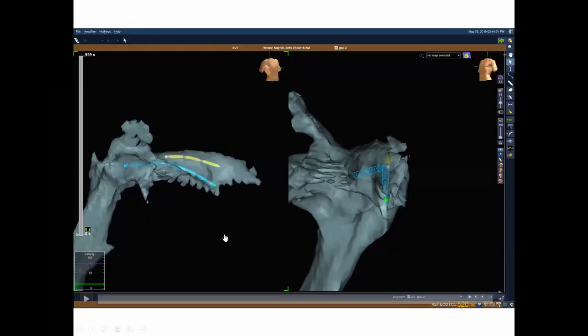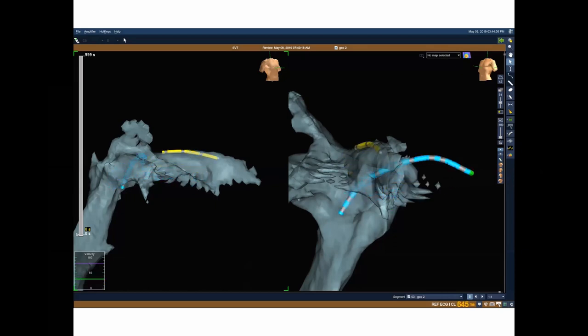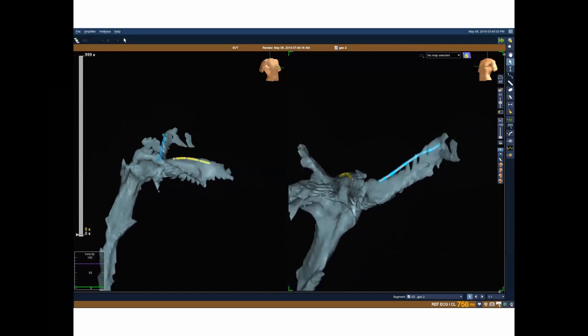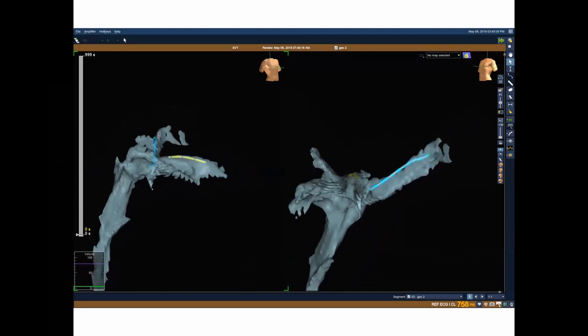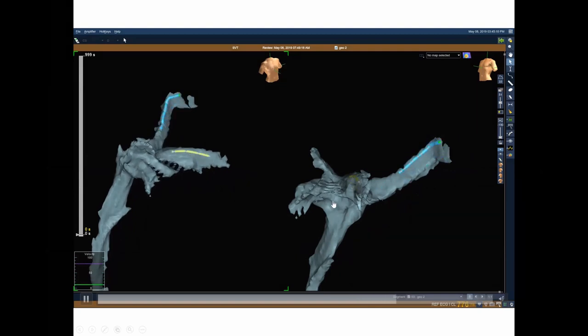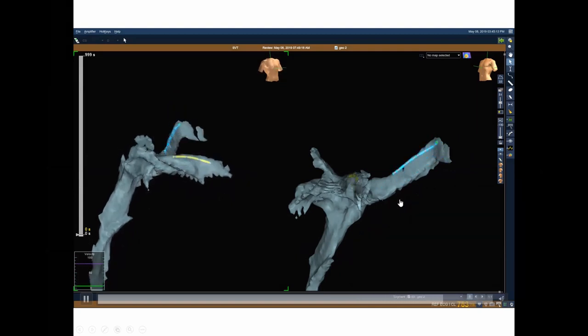So we've got the coolest technology of all the cardiology fields, and we've got excellent 3D mapping technology, and we can place our catheters in the heart without fluoroscopy. So this is like an RAO tilted up, and this is an LAO view over here. And you can see the blue decapolar catheter going into the coronary sinus in the LAO view, and you can see it going off here posteriorly, and the yellow catheters marking out the His location.